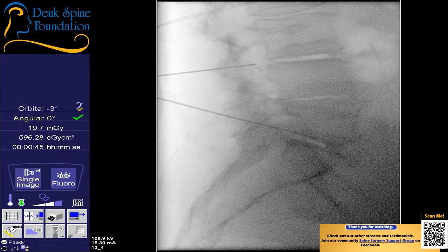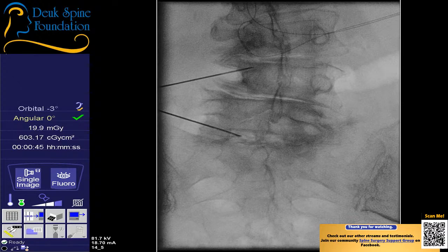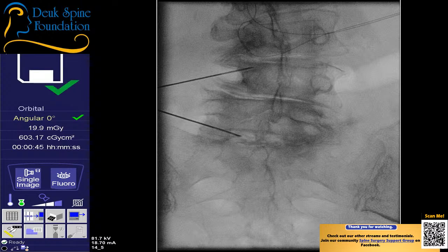So when you do this type of surgery, you're using the fluoro to navigate, because otherwise it's impossible to know where you are. As ugly as it looks there, it actually looks pretty good. We're in the right spot. We're just at the medial border of the pedicle. All right, let's go back. So I believe I am feeling the herniation here.